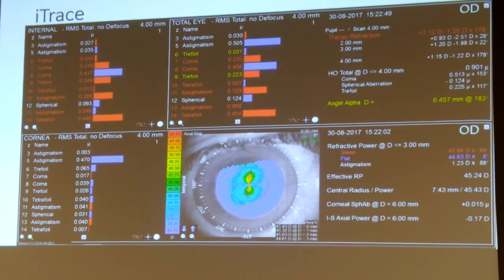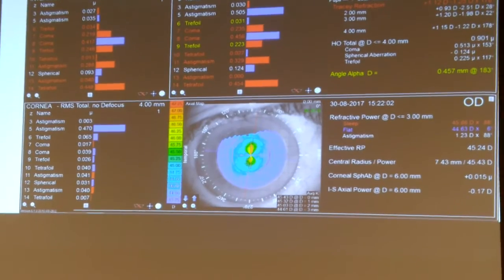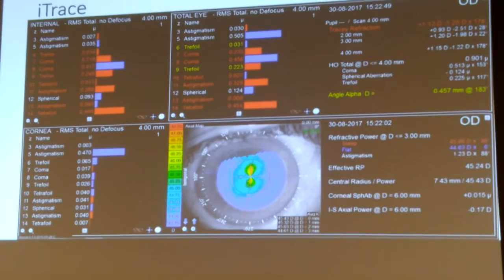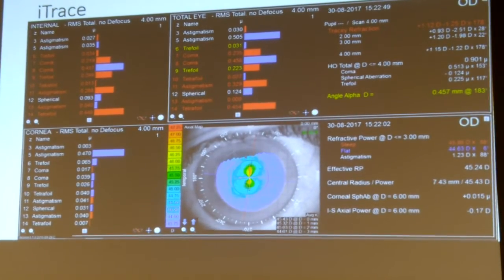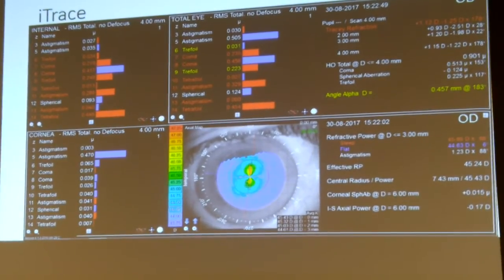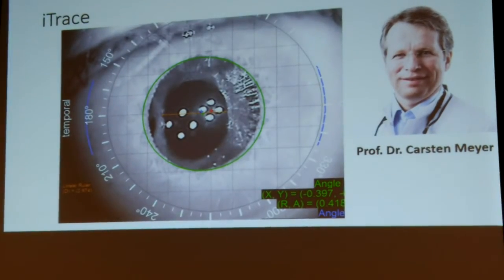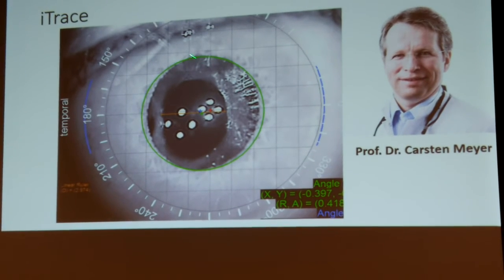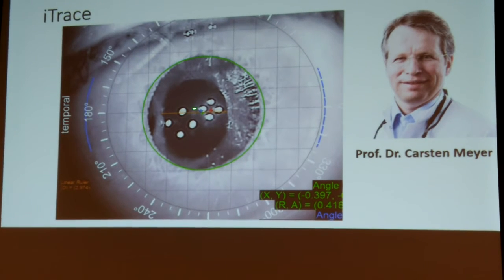Something is going on, and with the slit lamp we hadn't seen anything. When we looked undilated, the lens was clear, and the capsulotomy was already done before that. So for us it was a bit of a surprise. But if you look at the next picture, also done with Tracey, it's obvious why he probably has some problem. You see all this phimosis and stuff around here, but the hole is roughly 3 millimeters.